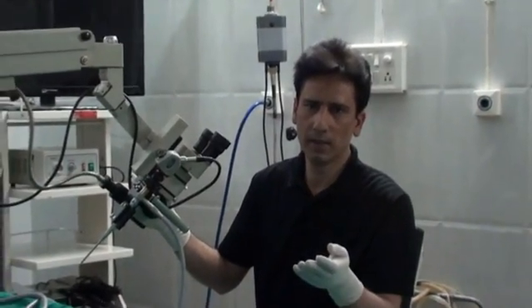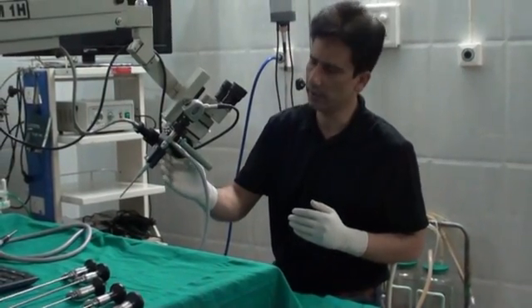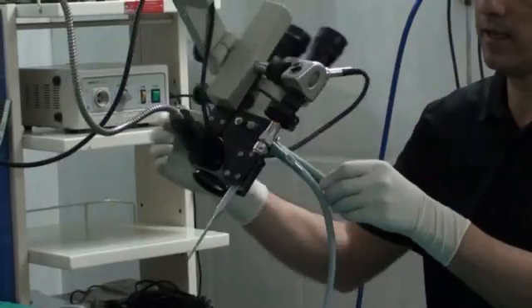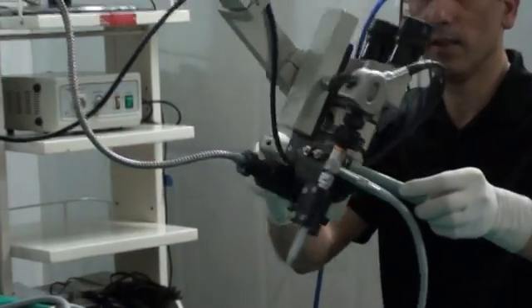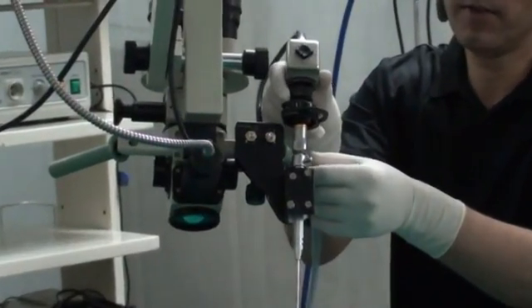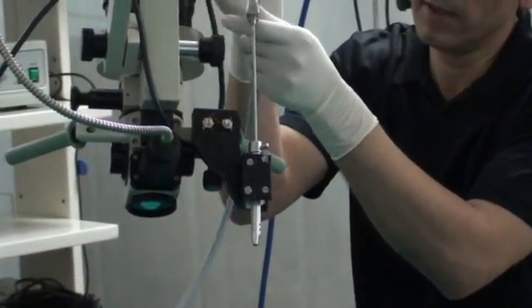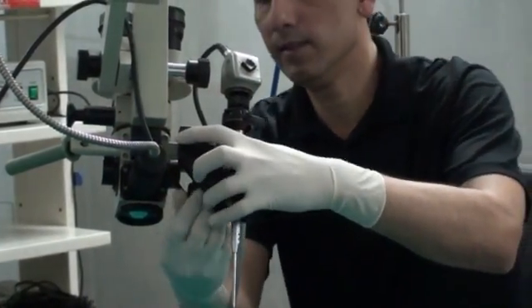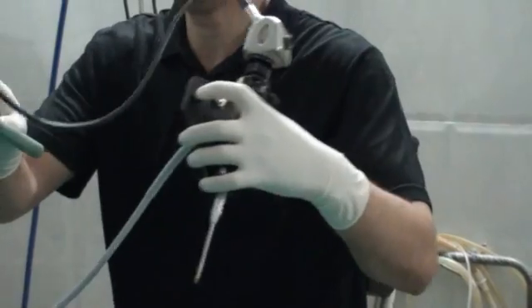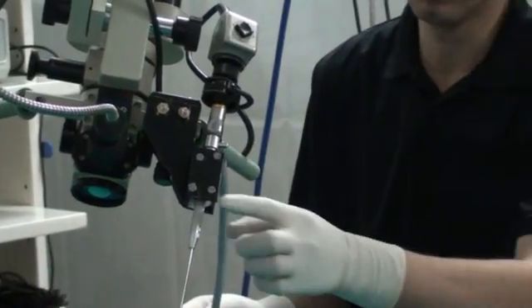A good assistant can help you out in this. This design gives you a very stable endoscope holder. You have got complete mobility just like your microscope and you are not wasting time — you can fix it anywhere. If you want to work with microscope alone, you can just remove the endoscope quickly. You can fix it and remove it within a matter of few seconds. It is fixed and it doesn't move even a millimeter — it is very stable.